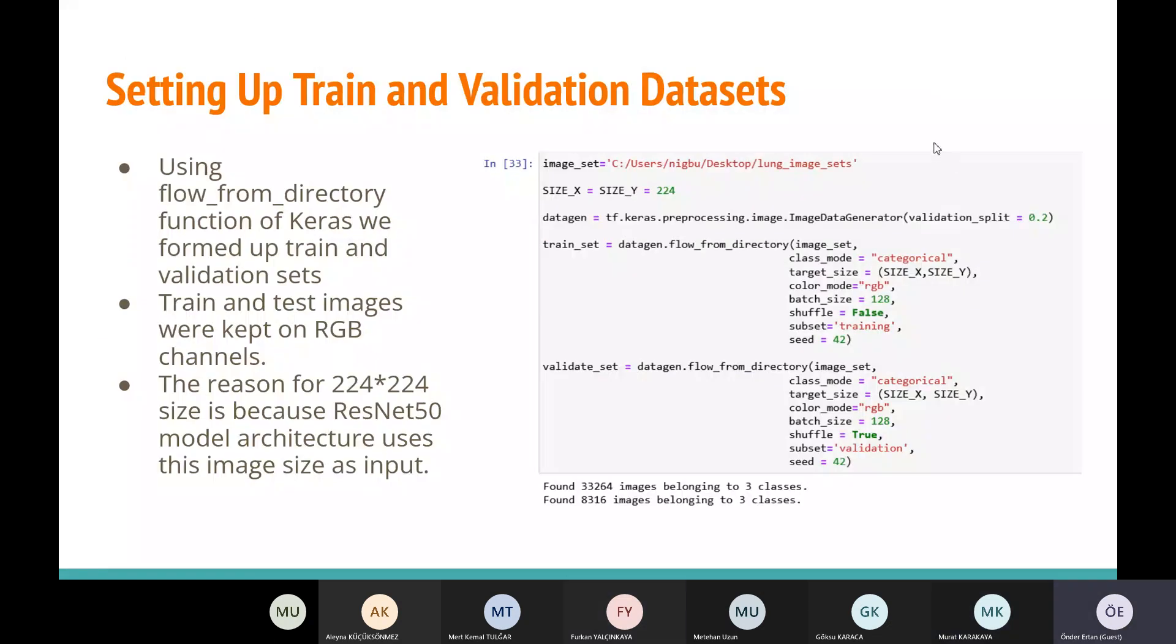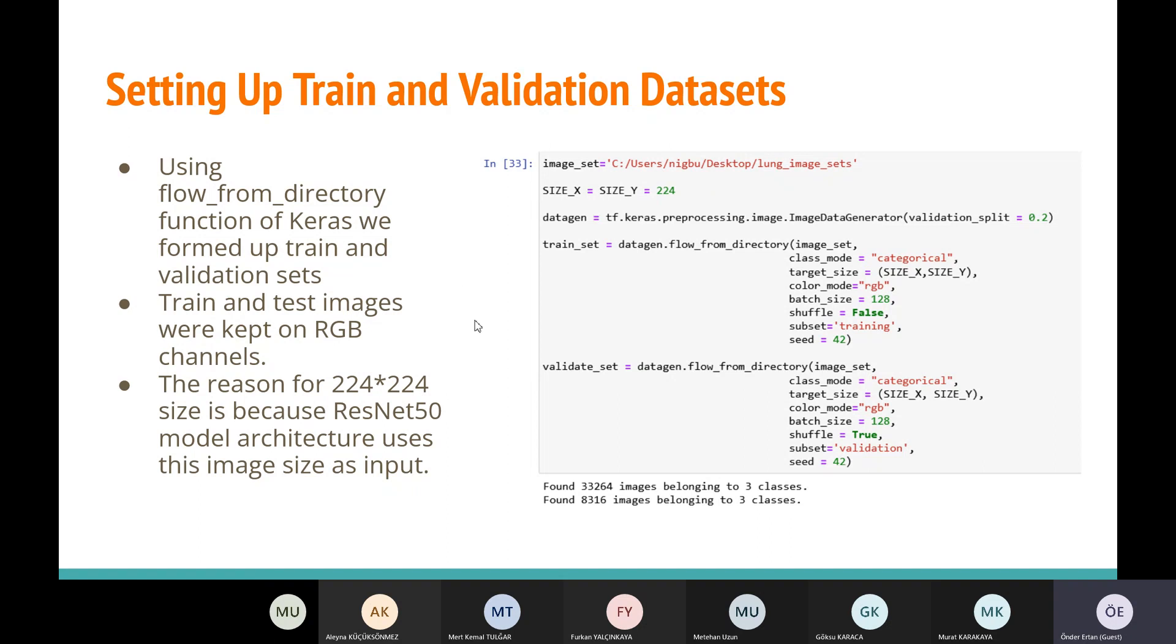Setting up train and validation data sets. Using flow from directory function of Keras, we formed up train and validation sets. Train and test images were kept on RGB channels because in our data sets, some of the images have similar colors from other classes, but we kept them in RGB.